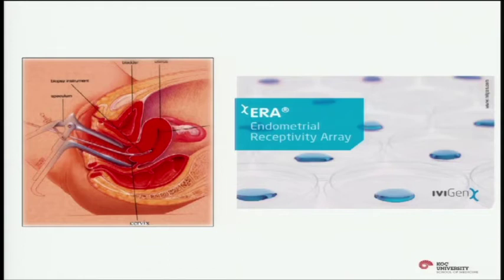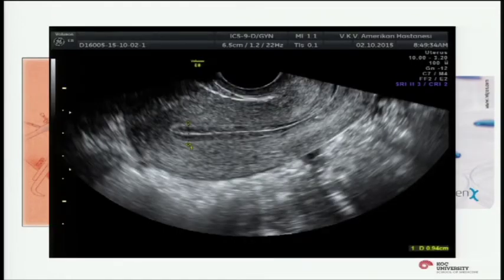However, what we'll be talking about is a pretty crude surrogate, which is endometrial thickness. You can see it in different ways. One is, it is inexpensive, it is readily available, and it still gives us a lot of information, roughly, but it only gives us information about the size of the endometrium rather than its function, probably.